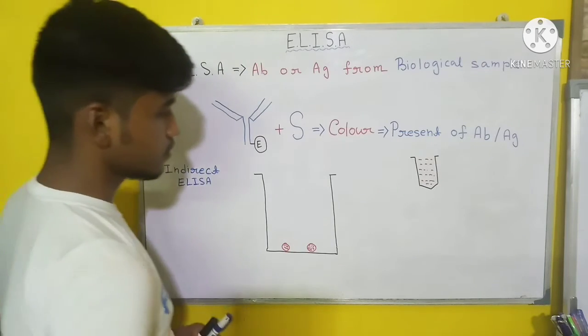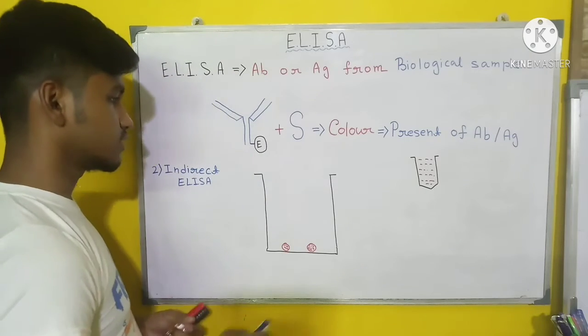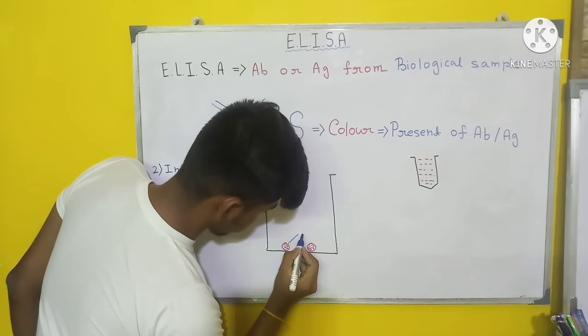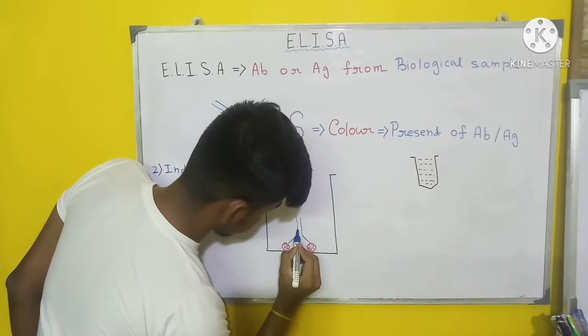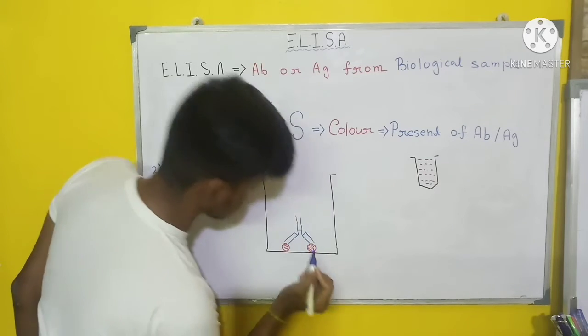So now when we put the patient serum sample in the well, we will see that the antibody from the patient serum sample will attach.